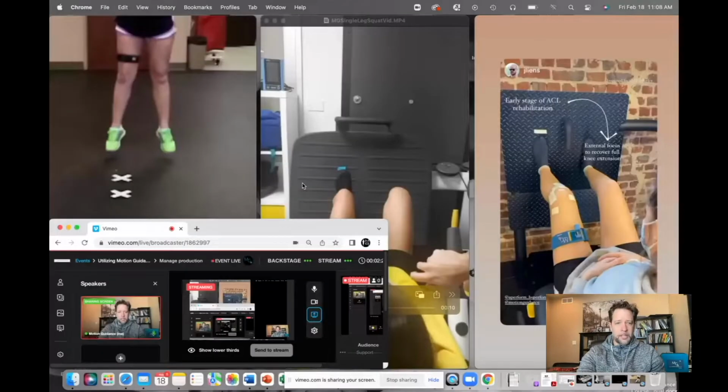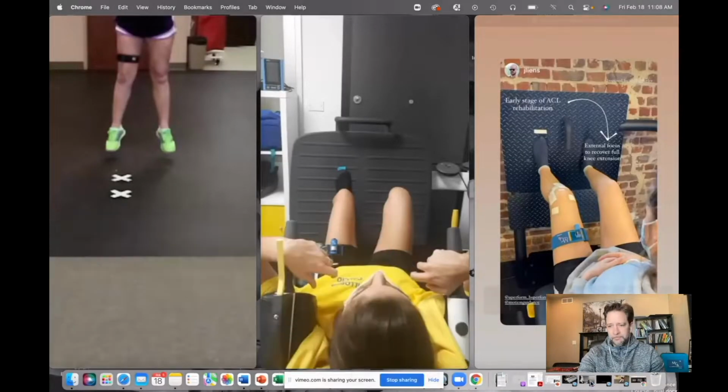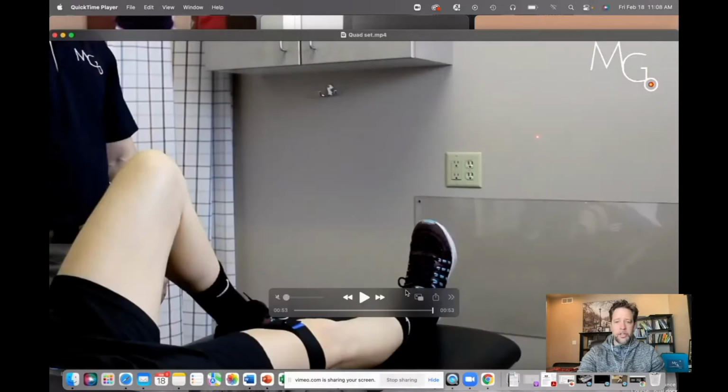So let's get started. I'm going to share my screen, and we'll start looking at some videos first designed toward the quad. So we'll look at setup and the application and what that means. All right, so let me share my screen here. Great. Let me get out of this screen, we'll minimize this. All right, so let's take a look at this first video.